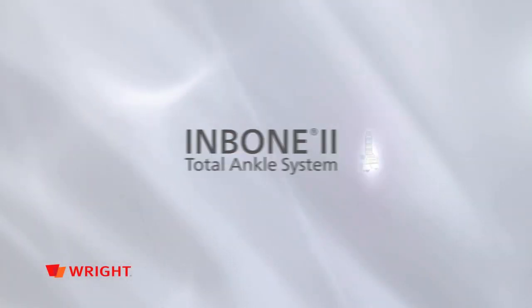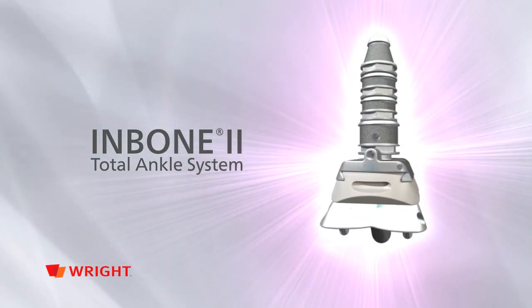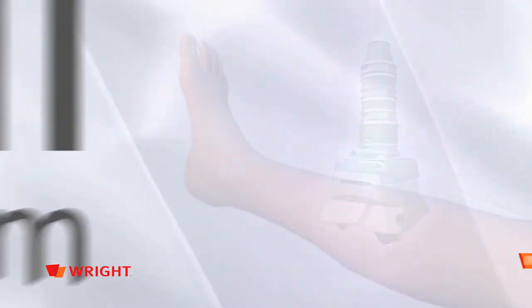InBone 2 Total Ankle Arthroplasty is a modular, customizable implant with the first and only precise intramedullary guidance system.